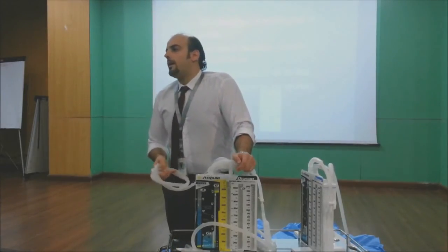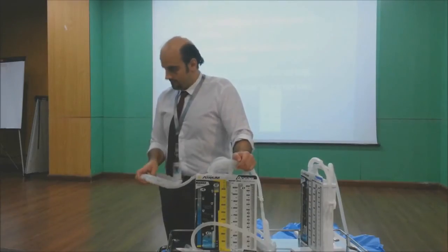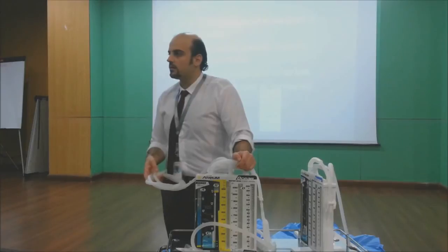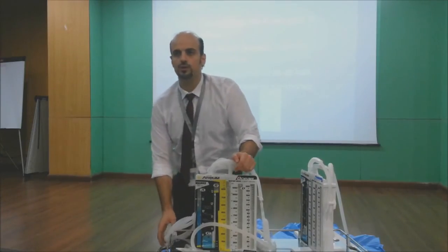So one patient we have is on the bed and another is a limb patient. This is a bilateral chest tube. So for this one, if we close the suction, as you said, if there is no oscillation, is it not working? No. You are right. This is a very good question.